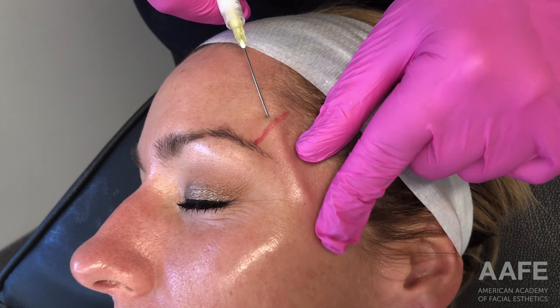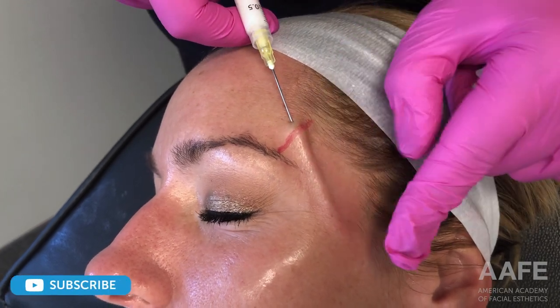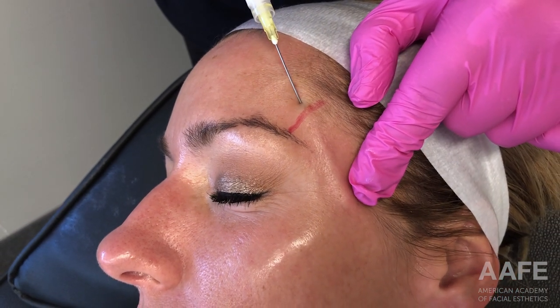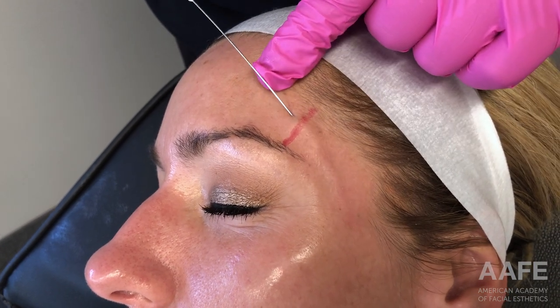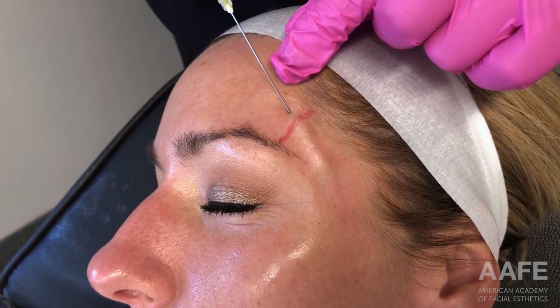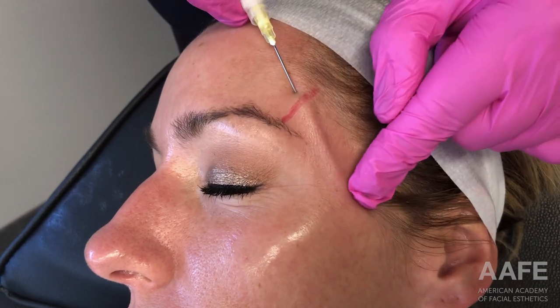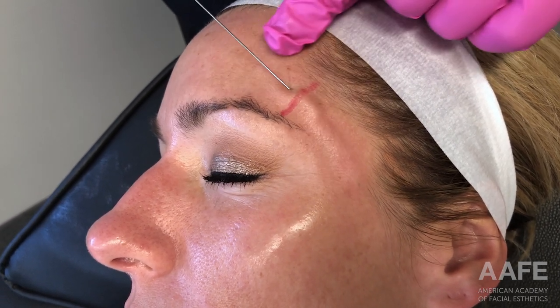We are going to fan the material into the temple to help restore volume that she has lost over time. When using a one-to-one dilution for Radiesse, you still get the volumizing effect. Once you dilute greater than one-to-one — for example, two parts diluent to one part Radiesse — you start to lose that volume-filling effect. This patient will get instant improvement, but the biostimulation takes time, generally three to six months to reach peak effect, so her results will continue to improve over time.